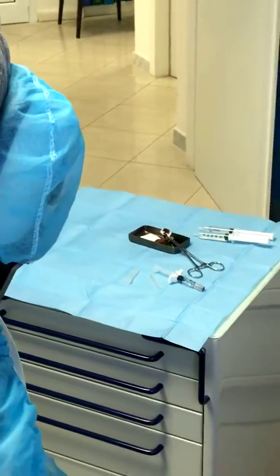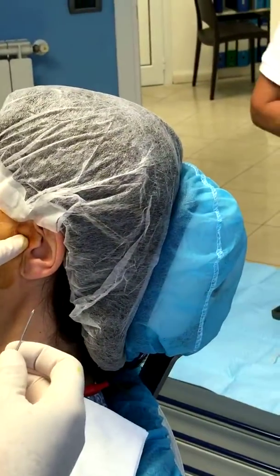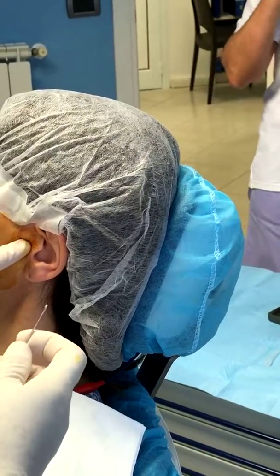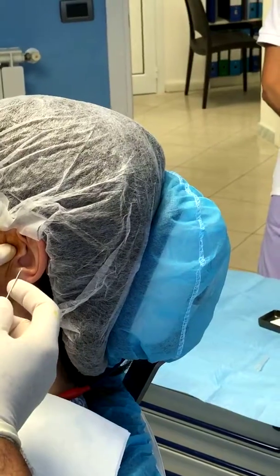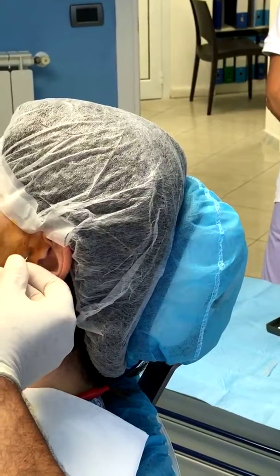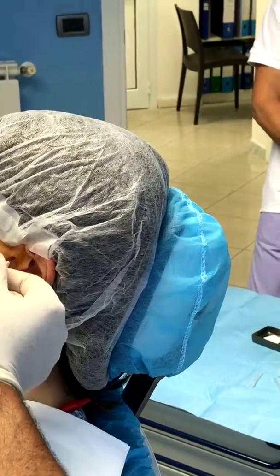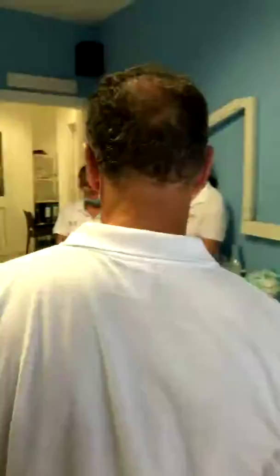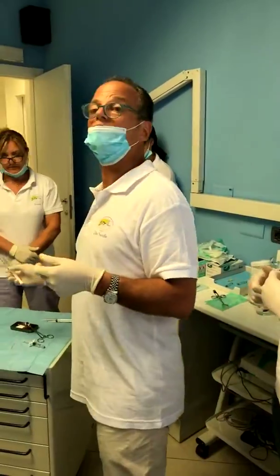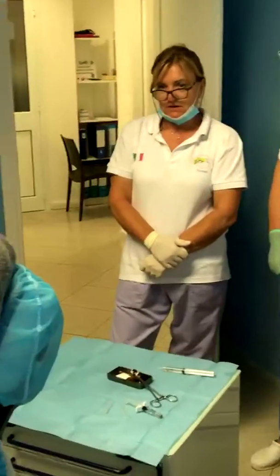So you ask the patient to open and close. Here — your finger here — and then you go. The patient has the feeling that a cavity has been entered. Now we try. If you're lucky, the solution comes out. If you're not, it will come out next time — that's not very important.